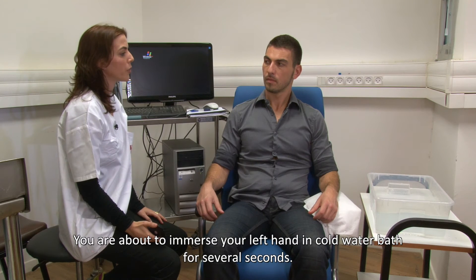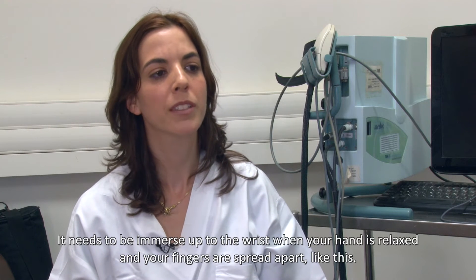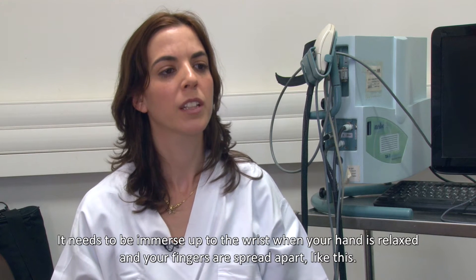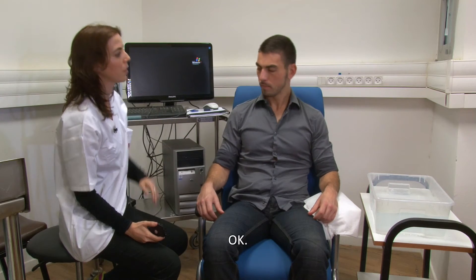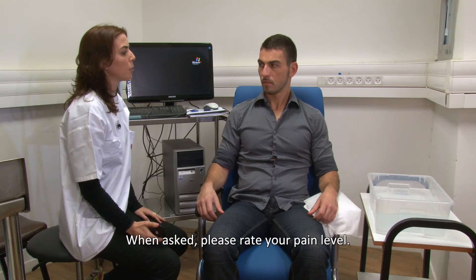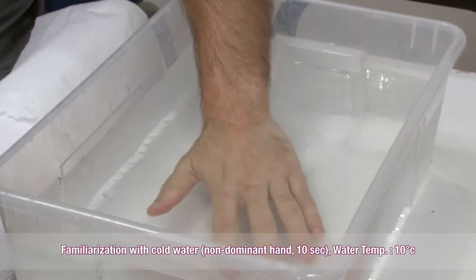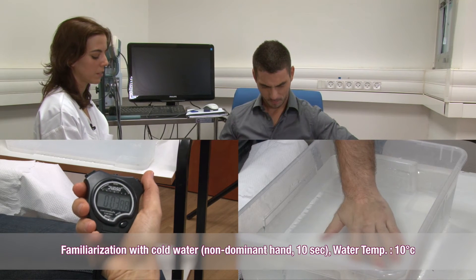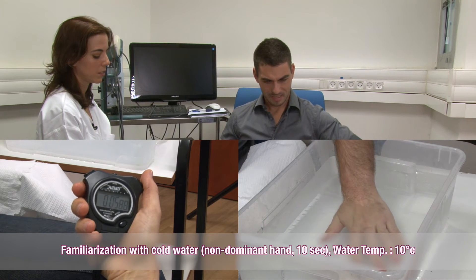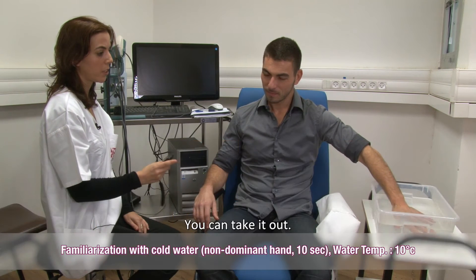You are about to immerse your left hand in a cold water bath for several seconds. It needs to be immersed up to the wrist, where your hand is relaxed and your fingers are spread apart — like this. When asked, please rate your pain level. Please immerse your hand. Now? 70. You can take it out.